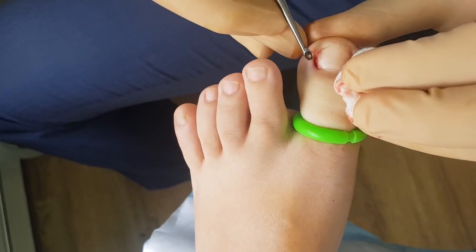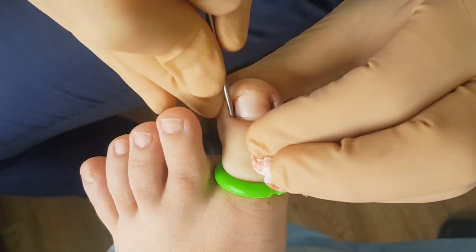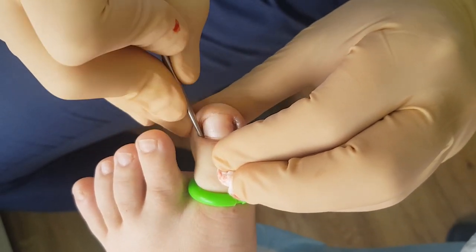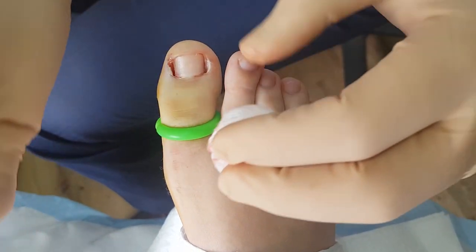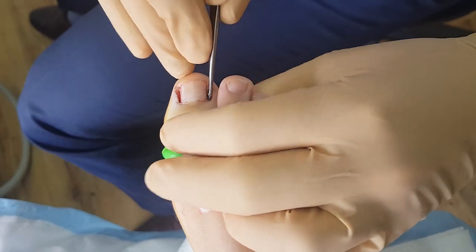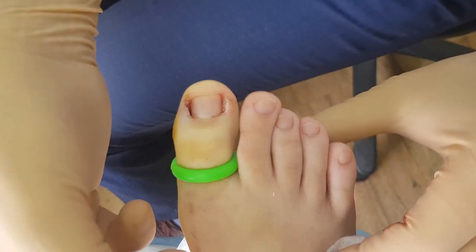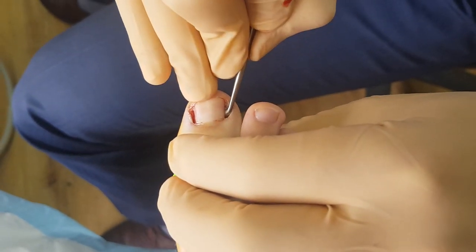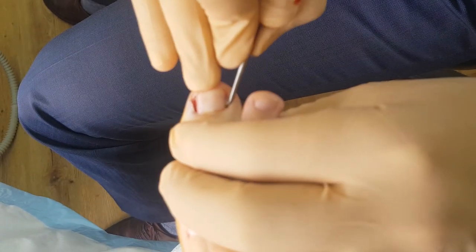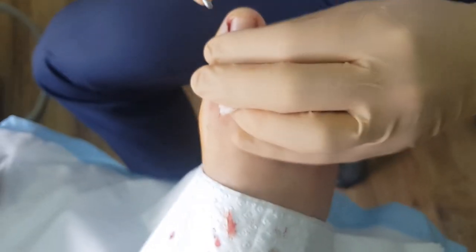I saw one of your previous YouTube videos about a phenol burn. Do you find using a curette and not lifting the nail prevents phenol getting underneath? Yeah — you just really don't need much. Sometimes I'll even use a smaller curette. Are you pretty strict on your time — 60 seconds times 3, or 45 seconds? I usually apply it until I see the tissue blanching. I don't go by time very often anymore. Once I see the tissue change colour, that's when I stop. Normally that's about 90 seconds to 2 minutes.